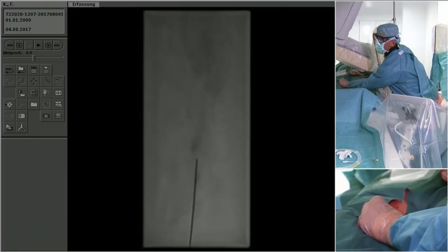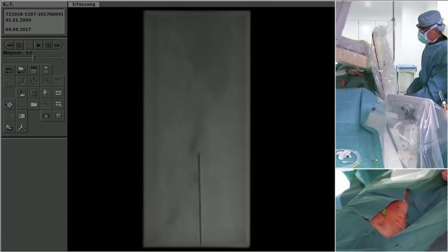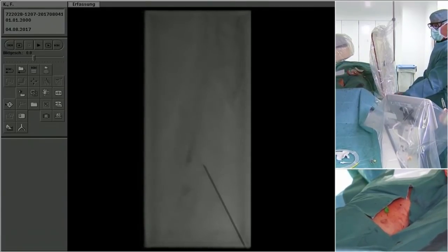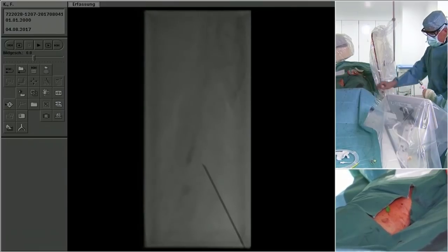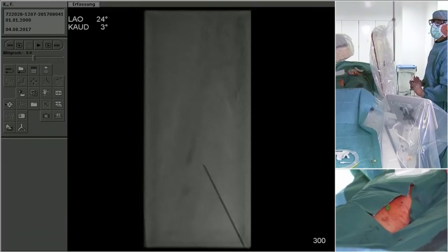Otherwise, I will try endovascular. Right, I see what you say. John, when Andrej started this case presentation, he said, I didn't try popliteal because the patient was not prone. So I want to ask you, in this particular case, if you had to do a popliteal access, would you do the frog leg approach?